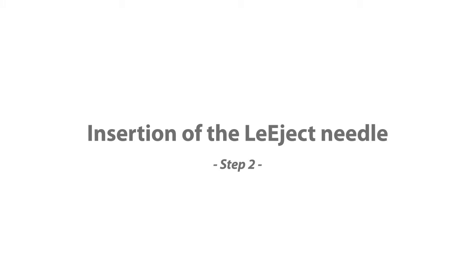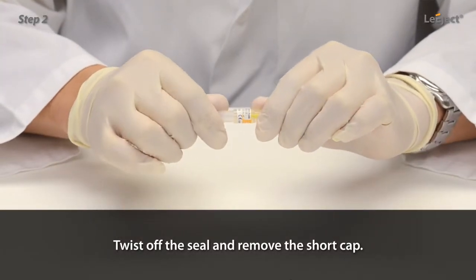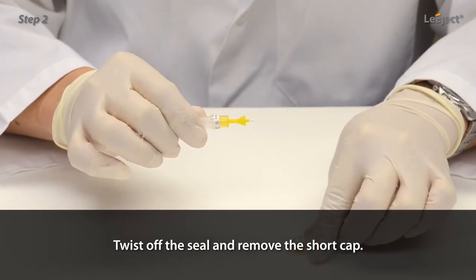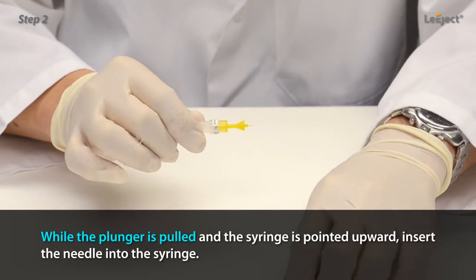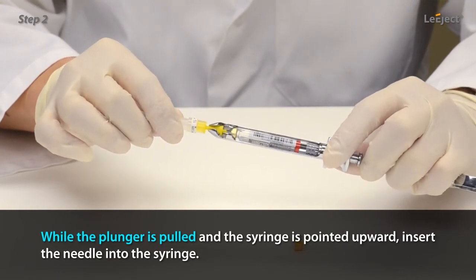Insertion of the Legex needle: twist off the seal and remove the short cap. While the plunger is pulled and the syringe is pointed upward, insert the needle into the syringe.